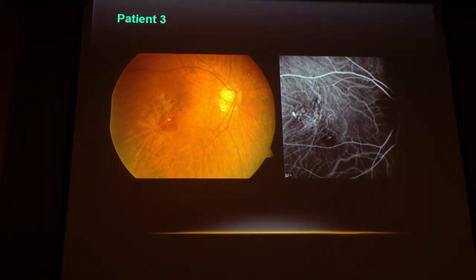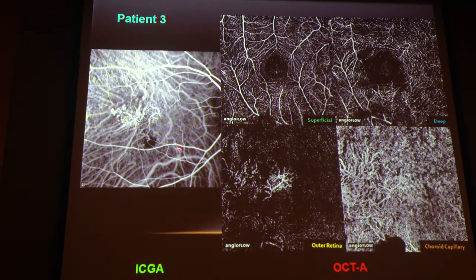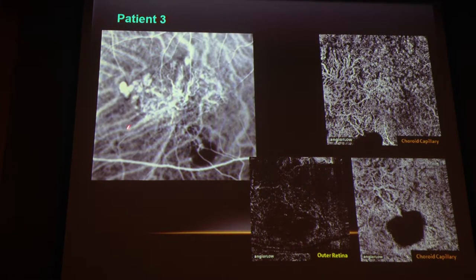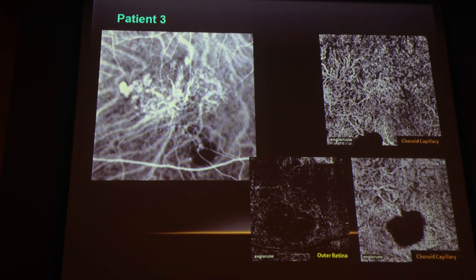Here's a third patient with a hemorrhagic pigment epithelium detachment and some irregular pigmentation. The ICG angiogram shows polyps as well as the BVN. We can see the BVN very clearly on the deeper layers — the outer retina and choriocapillaris. However, when we try to look for the polyps, we don't see them. On ICG we can see a hyperfluorescent nodule — I'm quite convinced it's a polyp — but on the corresponding OCTA image, we just see a hollow area. Could we confidently tell it's a polyp with only the OCT angiogram? I don't think so. That's a current limitation.